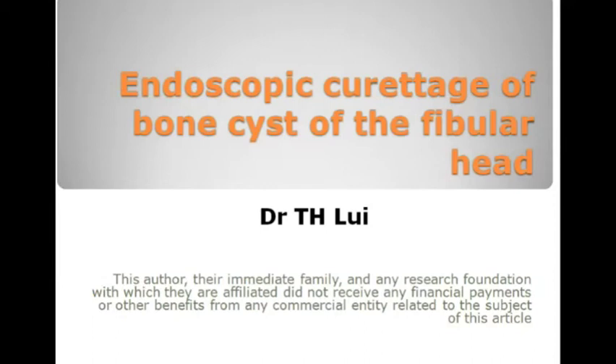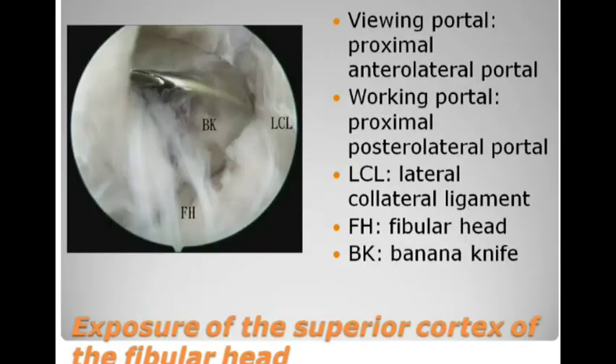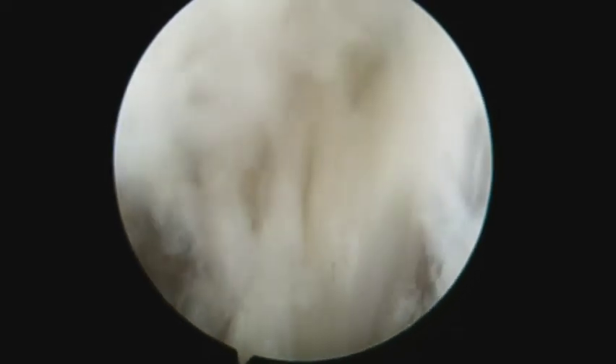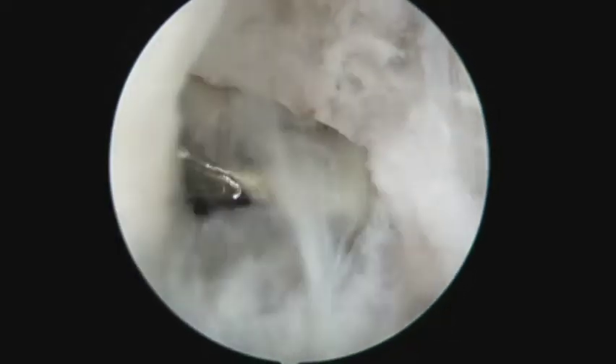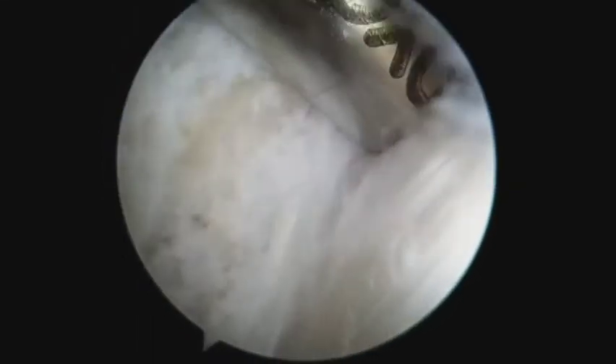Endoscopic curettage of bones of the fibular head. This is performed through the proximal, anterolateral and posterolateral portals. The initial working space is the potential space just above the fibular head and deep to the lateral collateral ligament.